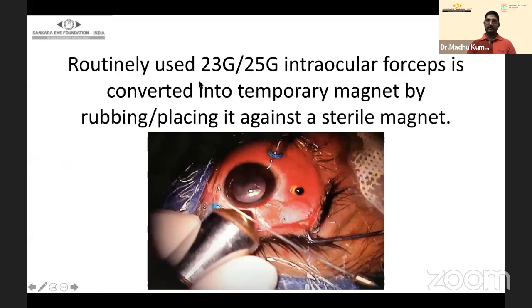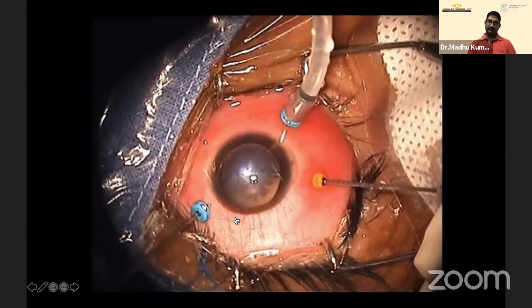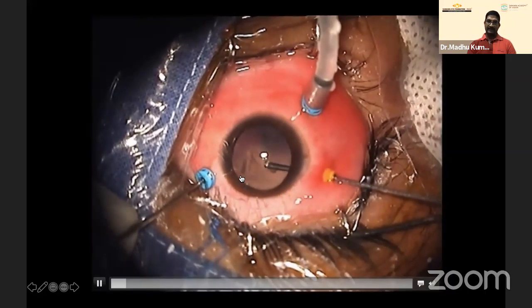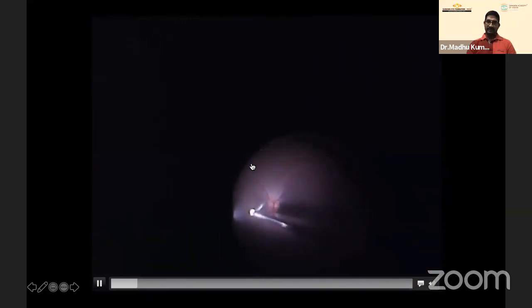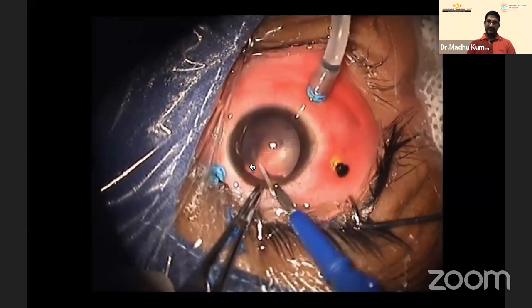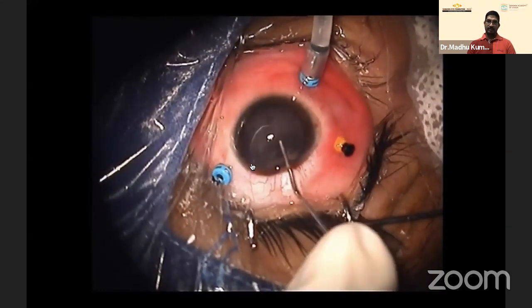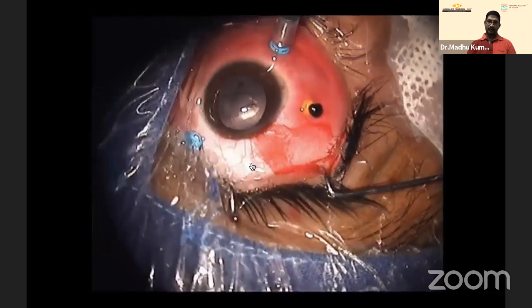To address this problem, we came up with an innovation: using a routinely available 23- or 25-gauge intraocular forceps converted into a magnet by briefly placing it in contact with the foreign body using the magnet. This is another case with a self-sealed corneal tear and cataractous lens. The routine steps remain the same — vitreous debulking, releasing the foreign body from all vitreous adhesions.